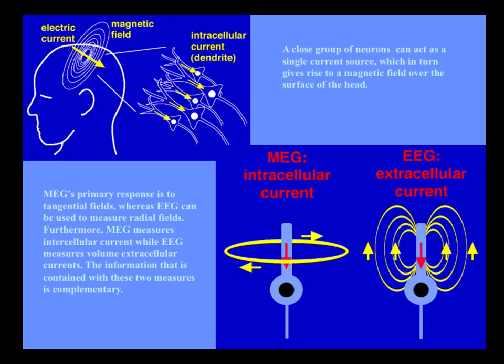So what we're looking at is really the direct electrical activity of the neurons. We're a little bit more of a direct measure compared to blood flow. The blood flow changes in response to the metabolic demands that are caused by the electrical activity of the neurons. We're actually recording signals that are directly generated by the electrical activity of the neurons.